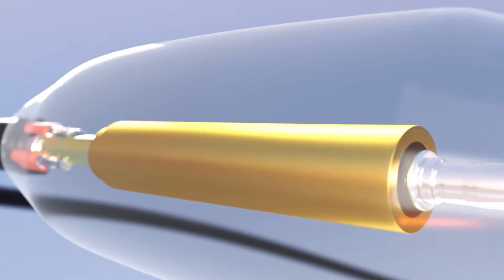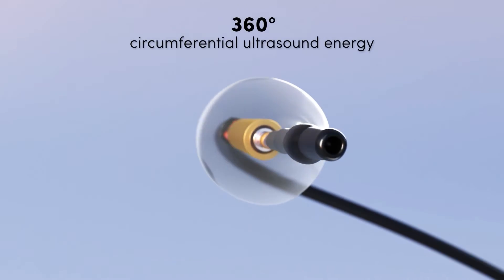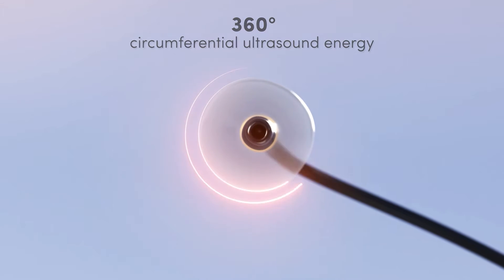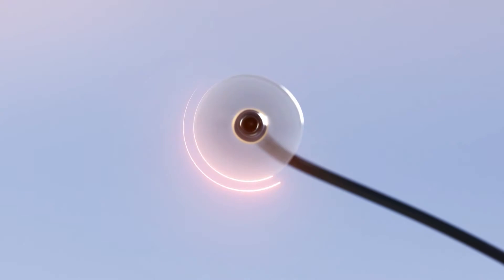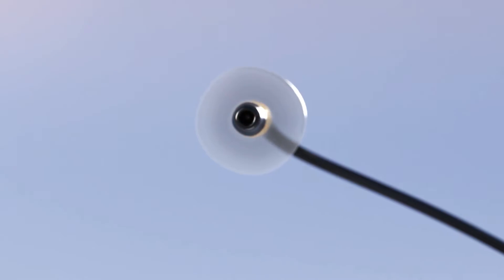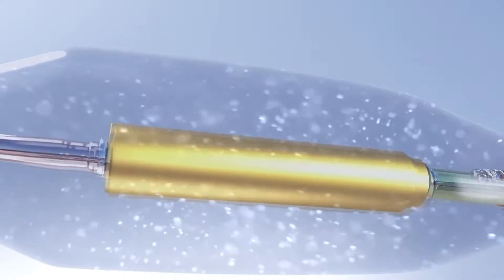The Paradise Ultrasound RDN system delivers 360 degrees of circumferential ultrasound energy through a balloon catheter to interrupt overactivity of the nerves surrounding the renal arteries and reduce blood pressure.